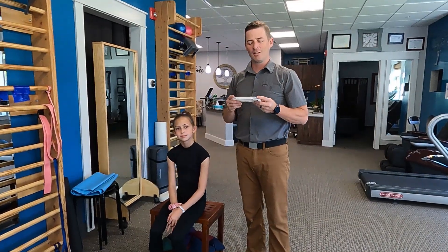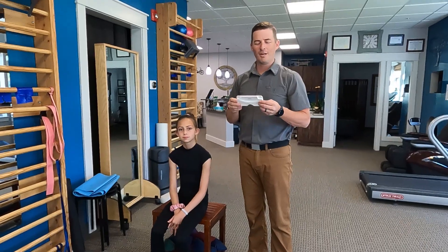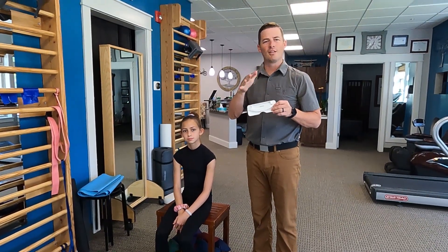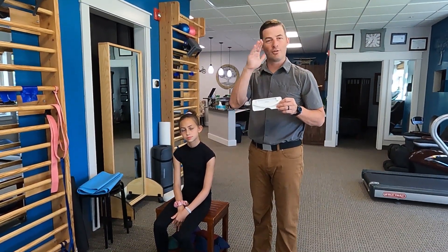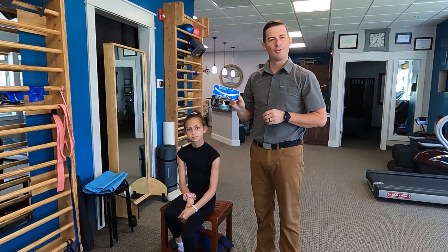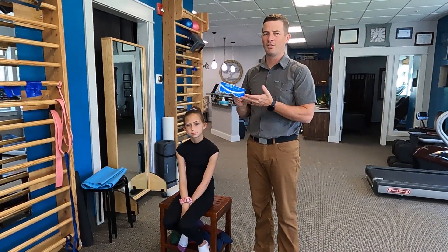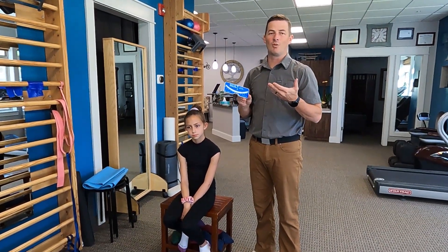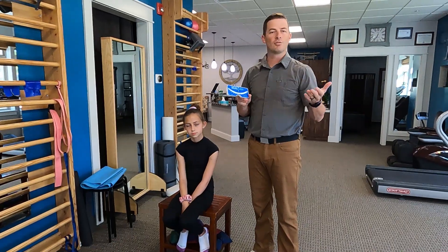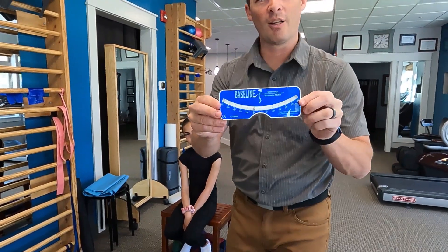Hi, Dave with Align Therapy here. We're going to talk about using a scoliometer. A scoliometer measures the rotation in the spine. It doesn't measure the scoliosis angle — the cob angle of the curve — but I want to show you how to use a scoliometer because it's a useful tool to monitor for progression of the curve, and it's a nice way to diagnose scoliosis as well.